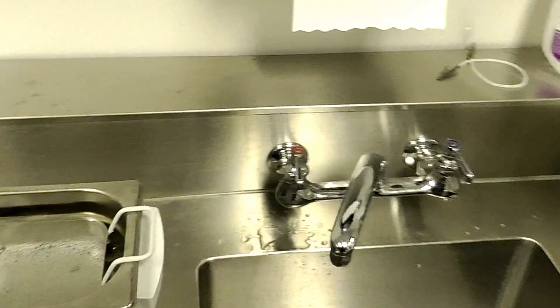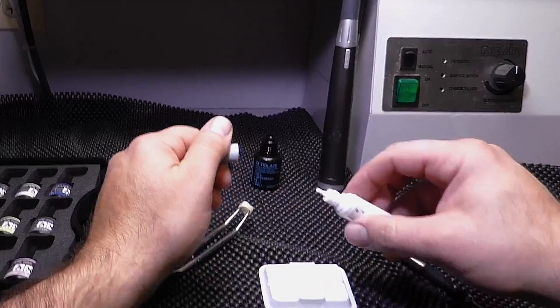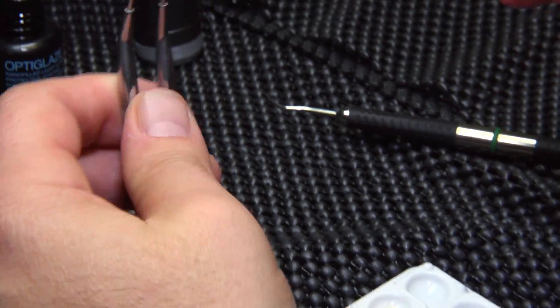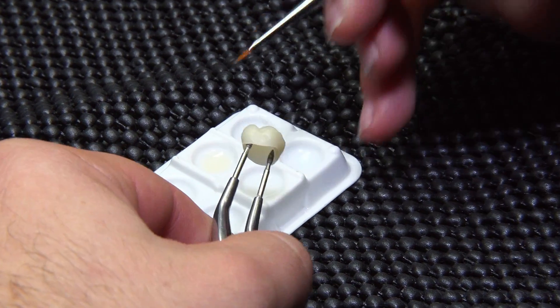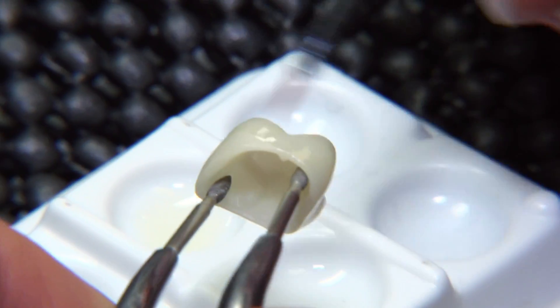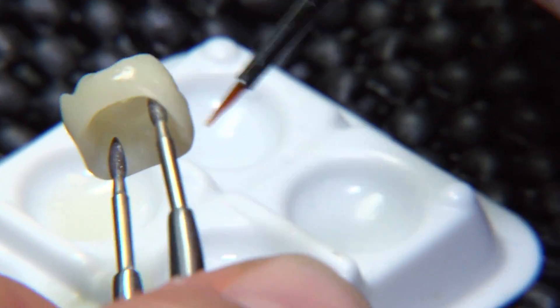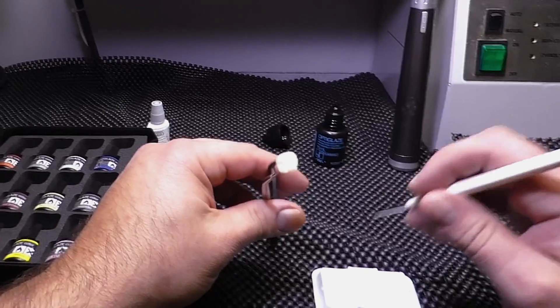Now we're going to be ready for the OptiGlaze. The next step is to take the Ceramic Primer 2 and add a little bit into our well. These palettes and the brush come in the OptiGlaze color kit. We apply Ceramic Primer 2 all over the surface of the restoration — just a very thin layer. This creates a bond between the OptiGlaze color and the Sarismart, giving you better adhesion.